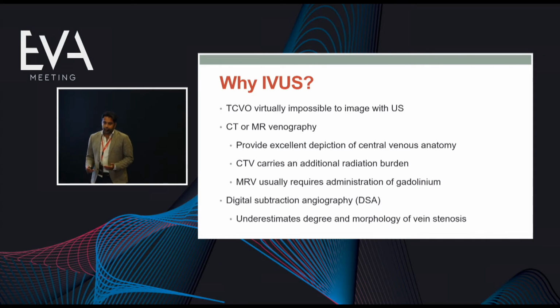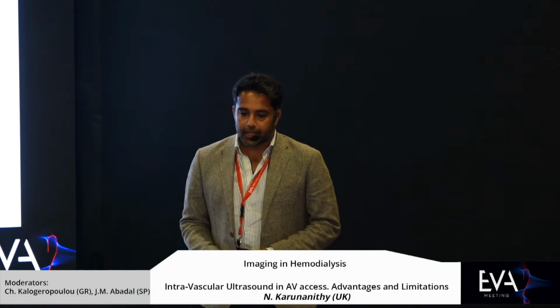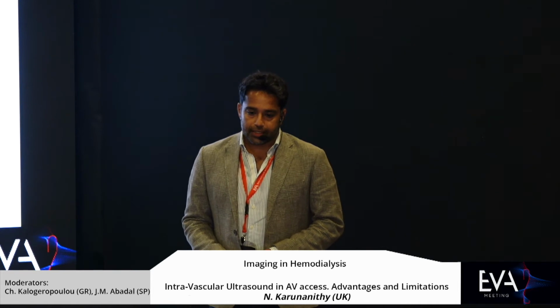So why do we need intravascular ultrasound? Just as a sort of critique of the other imaging modalities that we are familiar with. We know that ultrasound is very good at assessing anything from the humerus downwards, but in the central veins it's virtually impossible to assess the veins.